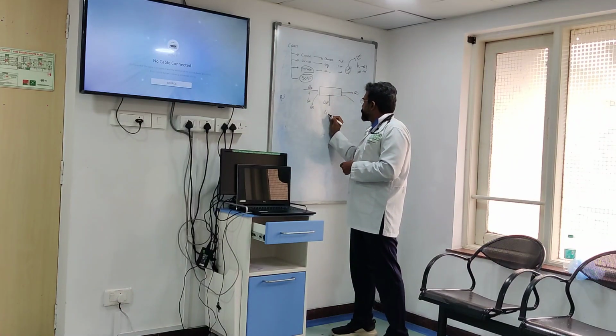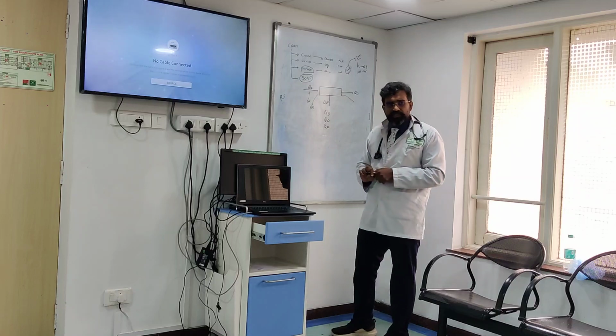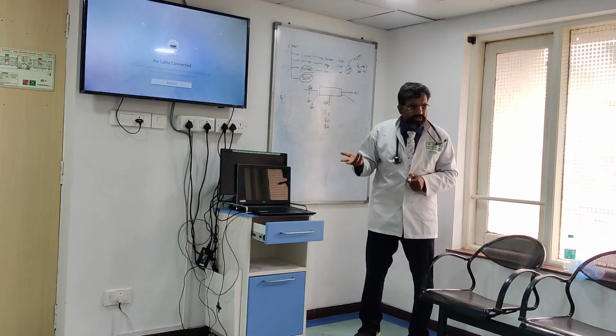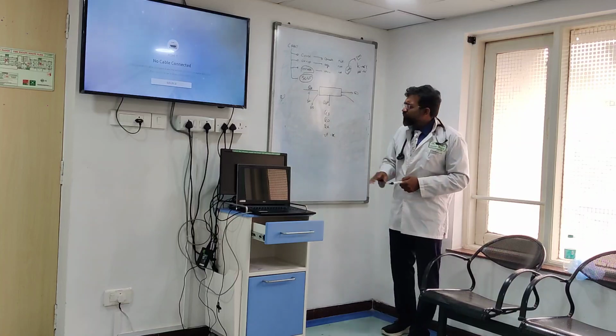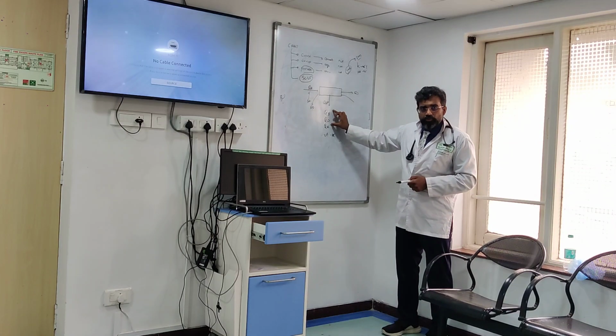So then in my equation here, I have to put blood flow, dialysis flow, and replacement flow. These 3 things I have to put, whatever happens. I am not concerned with fluid overload here, so I don't need to put a UF. My UF will be 0. I don't require it. So in this scenario, I want my dose also to be good.